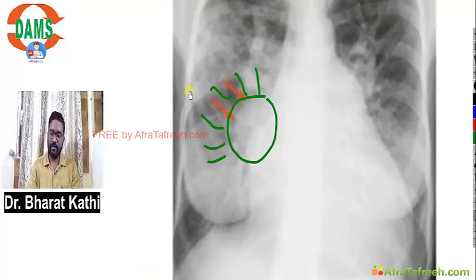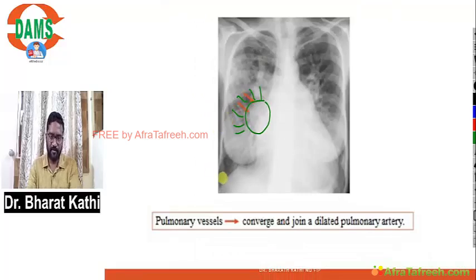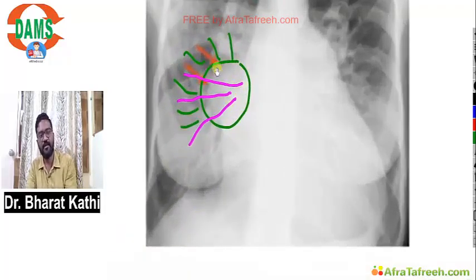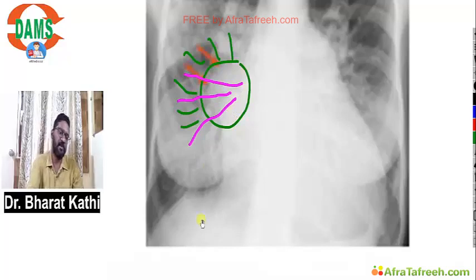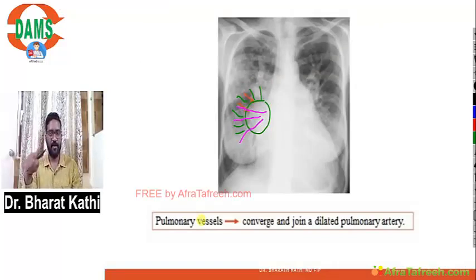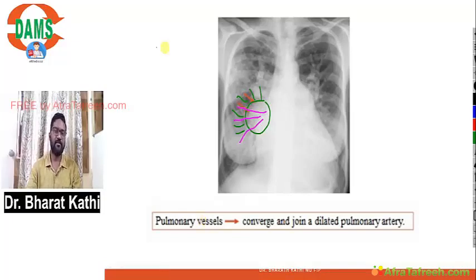If the vasculature is directly going into the heart, then it is considered a mass. So hilum overlay will tell you whether the mass is anterior or posterior to hilum. Hilum convergence, if the mass is at the hilum, tells whether it is an enlarged pulmonary artery or a mediastinal mass. So these are the things that you should know.